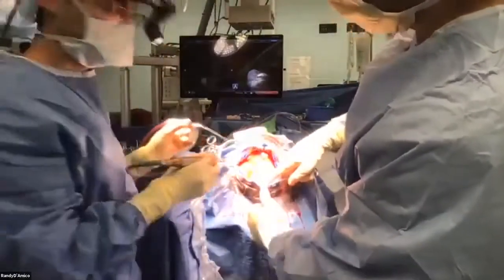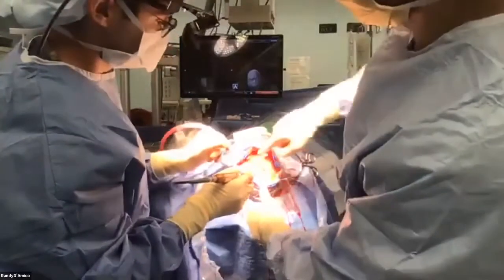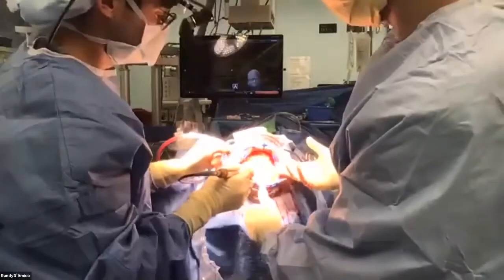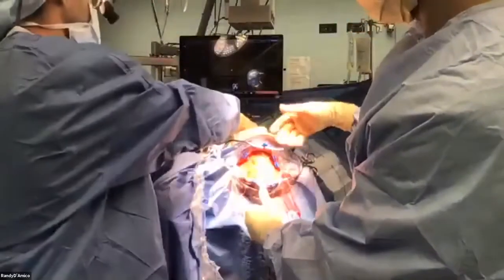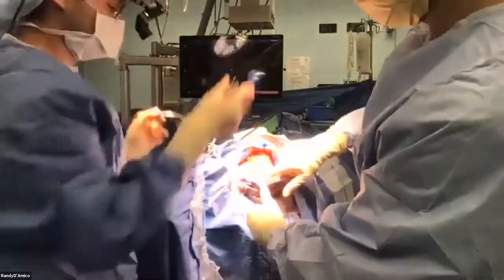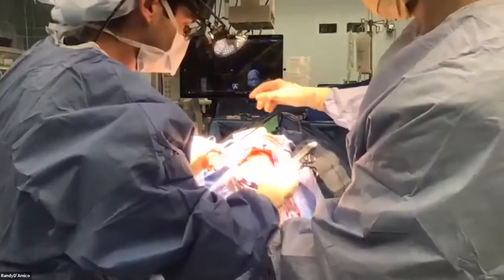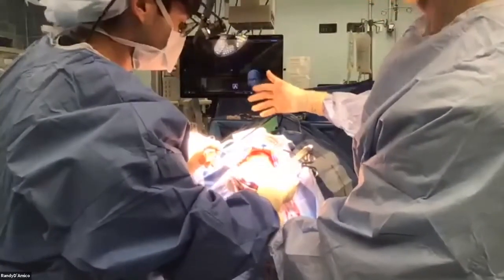I actually usually just run the foot plate to here, turn it 180 degrees, pull it out, run it from here to here, and then down there. You never want to drill towards the superior sagittal sinus. You always want to drill away from it, and that will get you a nice clean exposure. The difficulty here is that the tumor is going to be stuck to the superior sagittal sinus right here, so you have to be super careful not to unroof that. It happens.